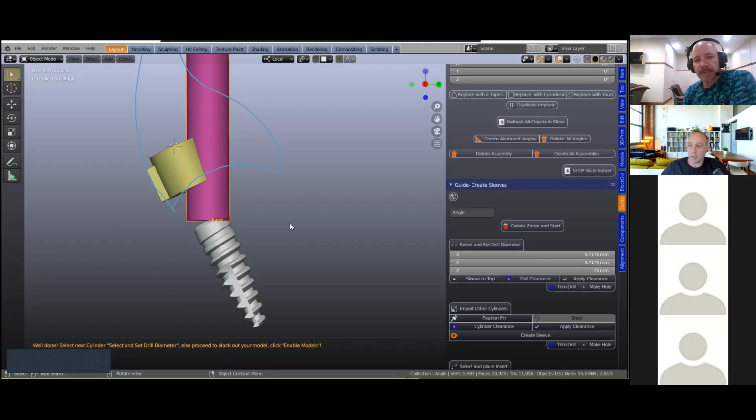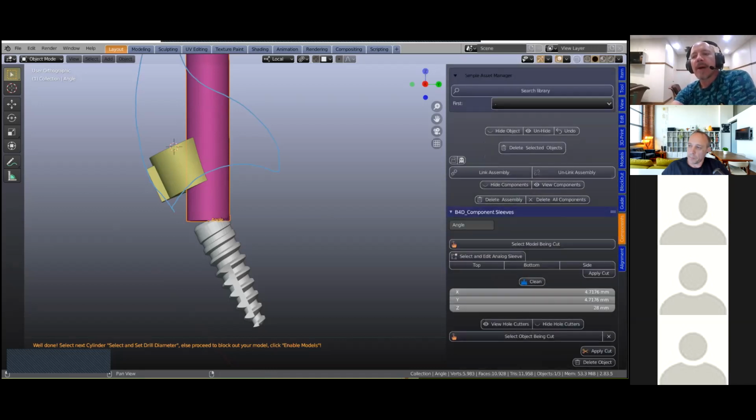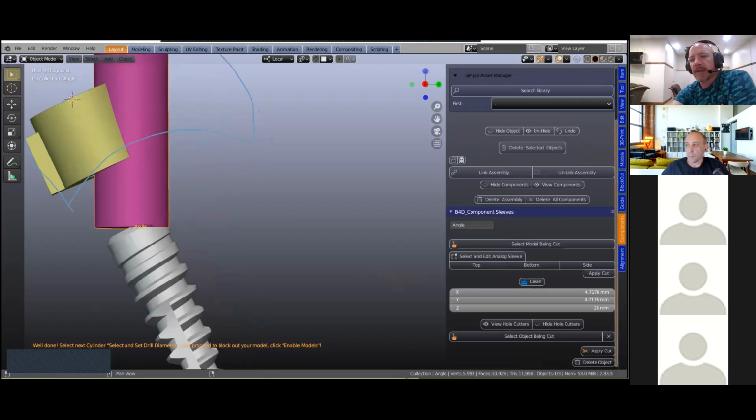Medentica have most brands of implants, all the known brands. But as far as making models are concerned, we've got ELOS components as well. Sorry? Can you publish the measurements of the abutments, the sleeves, and that you use? So can we adapt? We can adapt to that. We've got them according to their order numbers. So if you look at the catalogs.